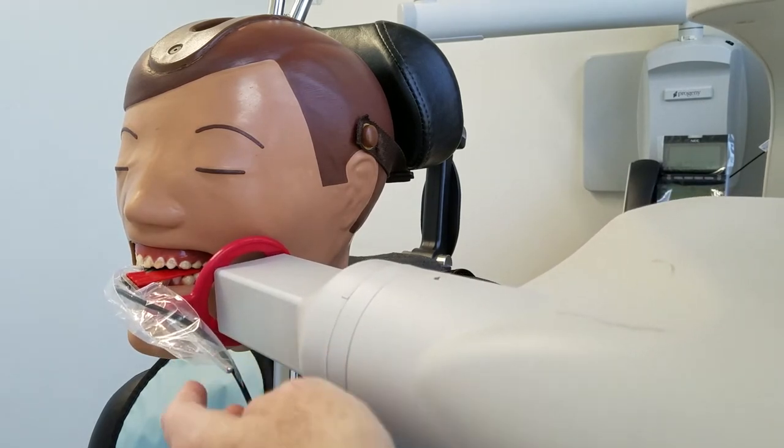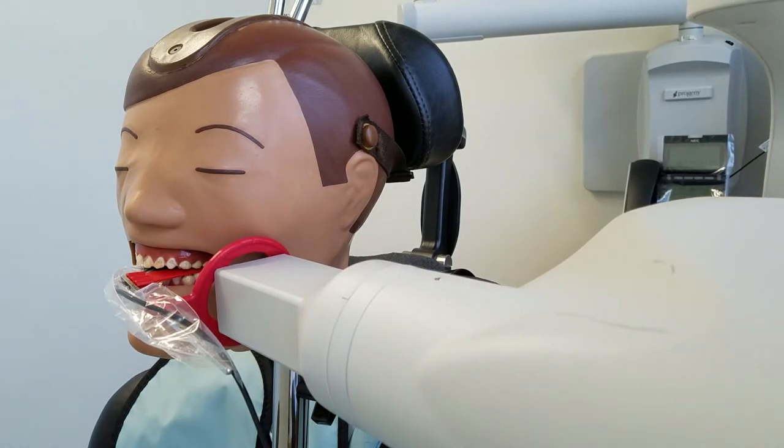I can tell just by looking that this is way too low, so I'm going to pause the film, play with it for a minute to see what's going on, and then we'll resume.